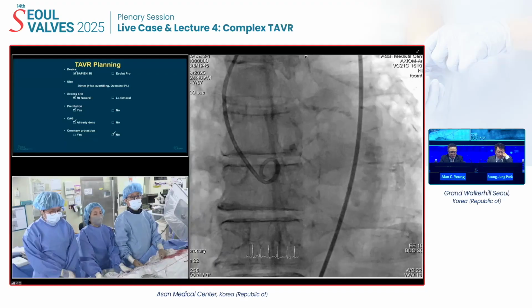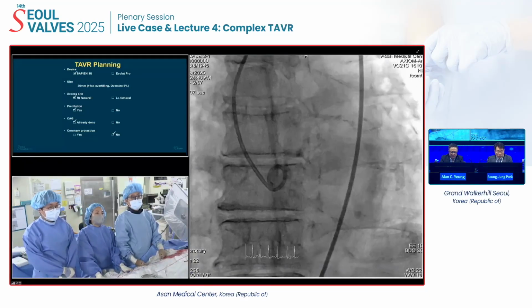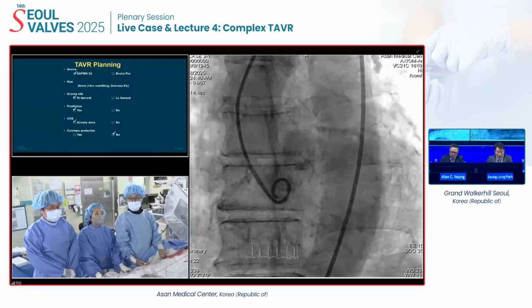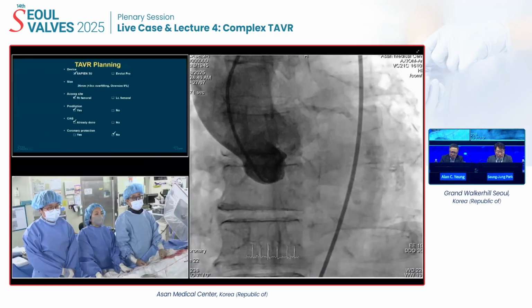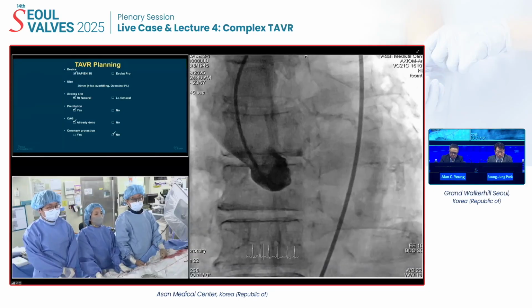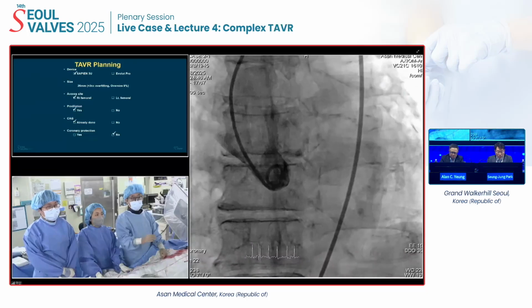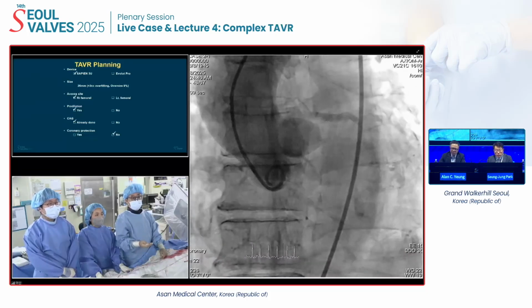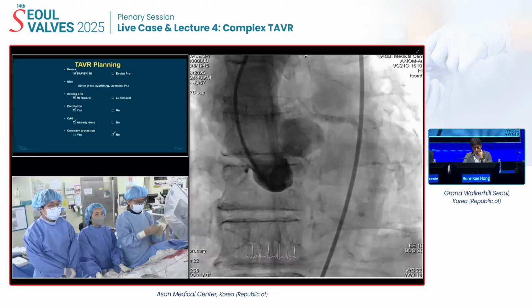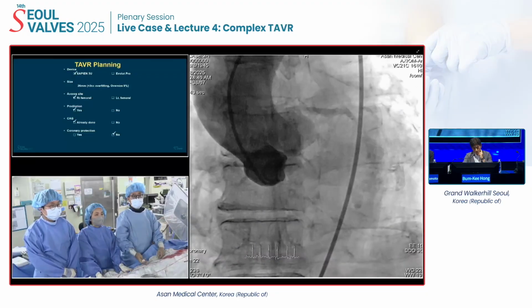Yes, there's a concern sometimes if you have a pretty thick septum. Absolutely. Sometimes it's SAM combined with hypertrophic LVOT dynamic obstruction, and that can be vulnerable to suicide LV. We experienced two or three cases after implantation where blood pressure dropped, and there was severe hypertrophy. The dynamic LVOT obstruction happened at that time, so we gave full drip hydration.